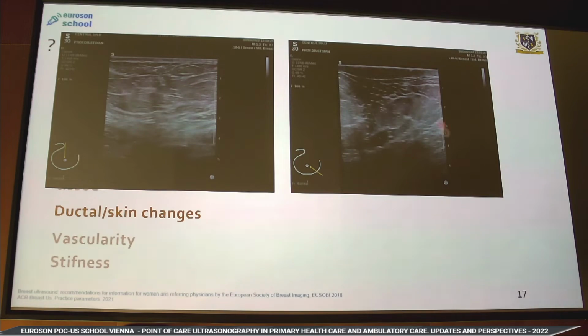situation, even though in this image there is not a clear tumor. But still, once I get to see something like this, and if it's not after external radio treatment, it's a high-risk image. You don't necessarily have to find the tumor, but a sign should be in your head and you should refer it.